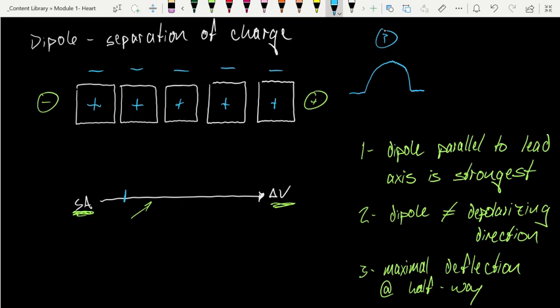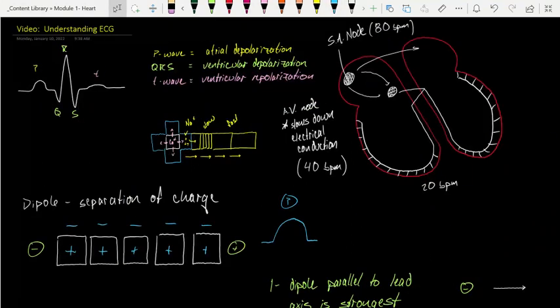We're going to continue in a second to map all of this out and show exactly how to create the QRS wave and the T wave and all of that. But I just wanted to take a minute to review what we have with our understanding of how the EKG works. So the EKG itself, the reading, it's made up of a P wave, a QRS complex, and a T wave that we've defined as atrial depolarization, ventricular depolarization, then ventricular repolarization.